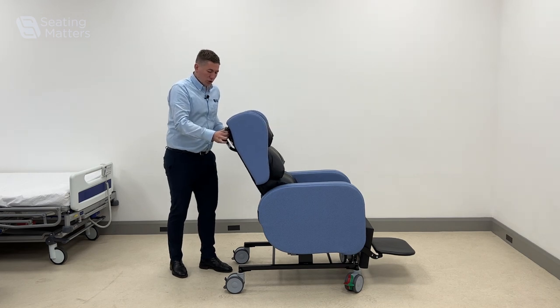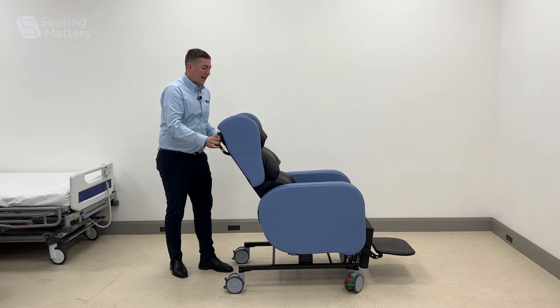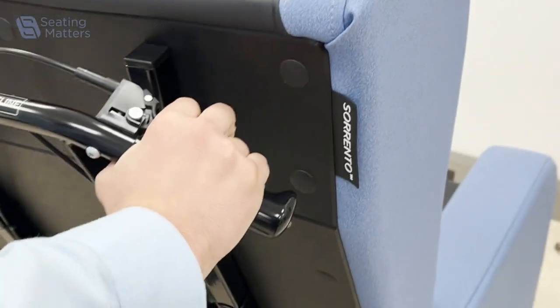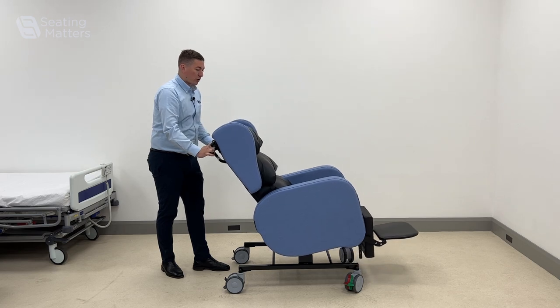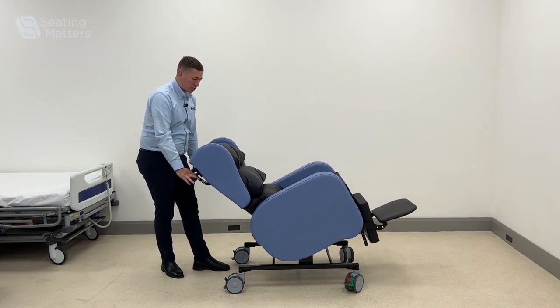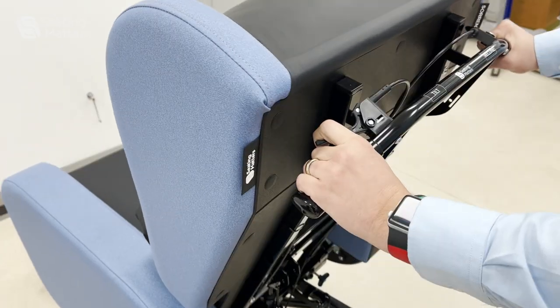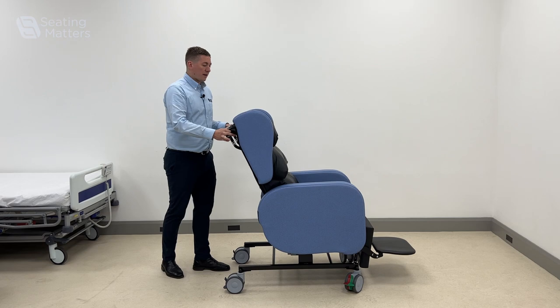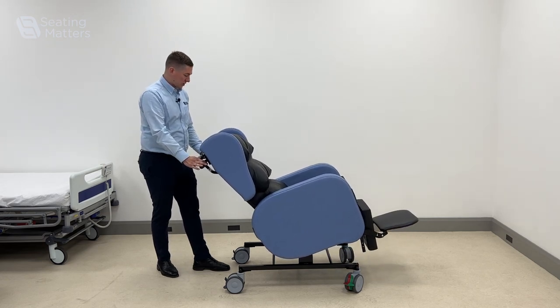On the right hand side, we can use this lever to change the angle of recline on the back to allow us to fit to the patient's hip angle. On the left, we have the lever for tilting in space. This is adjustable — we can stop it at any position — and it allows us to tilt the chair for pressure redistribution and to keep the patient in a safer, better position.